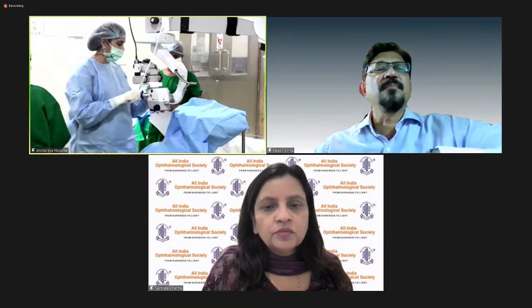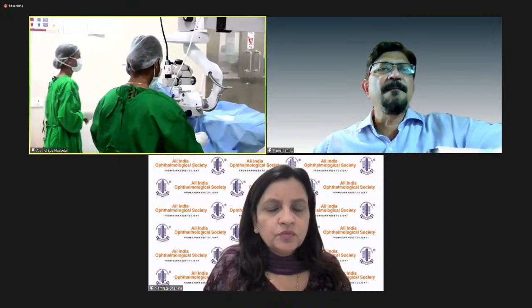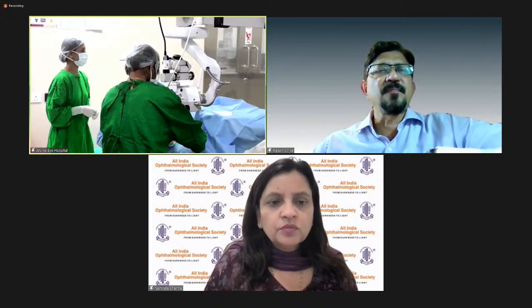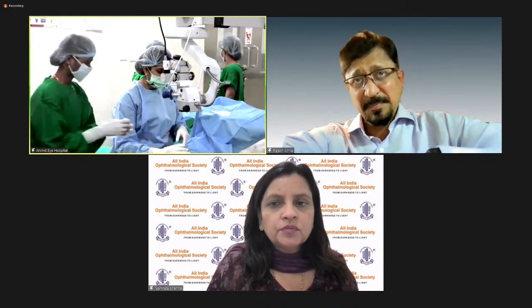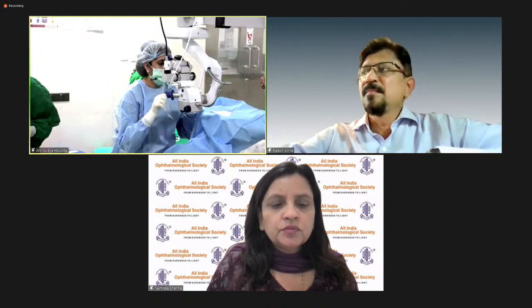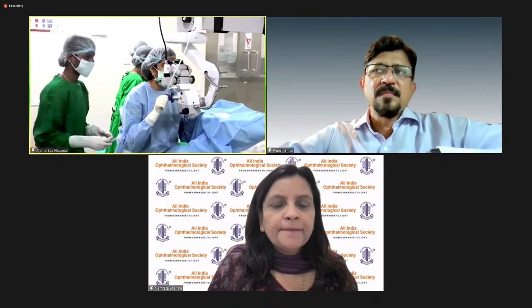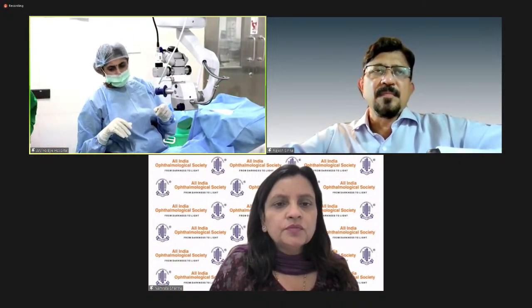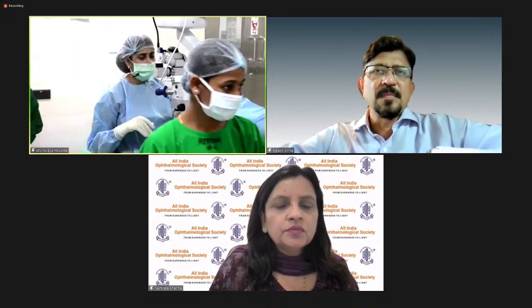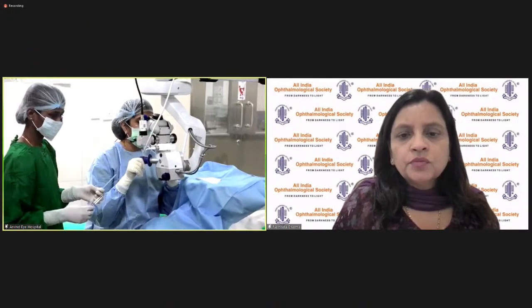So we're planning the Vivity lens. I think there is a lot more focus today on presbyopia correction along with cataract surgery. And thankfully, we are at an era when we have much better options. And the Vivity IOL, the newer EDOF lens from Alcon, is a wonderful lens where the patient gets excellent intermediate vision and excellent functional near vision as well.